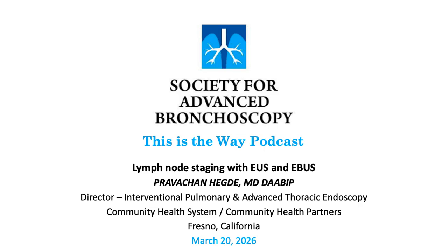For example, if there is resistance, you don't push. And if you're insufflating, it's better to use CO2 rather than air to mitigate complications. Those are some of the things. But to answer your question, most people who have been doing EBUSs become pretty comfortable after about 25 to 50 cases. And once you reach 100 cases, you become very proficient.